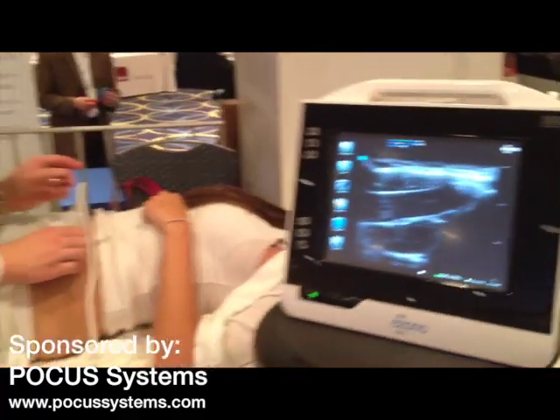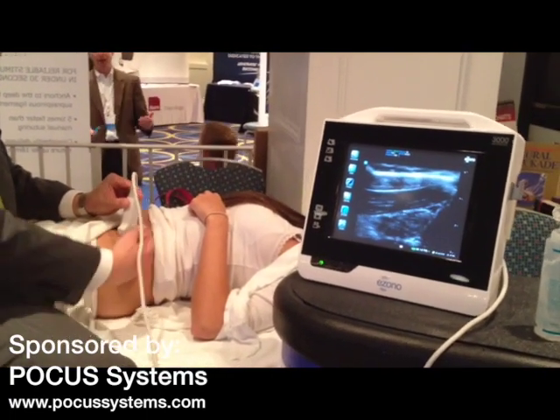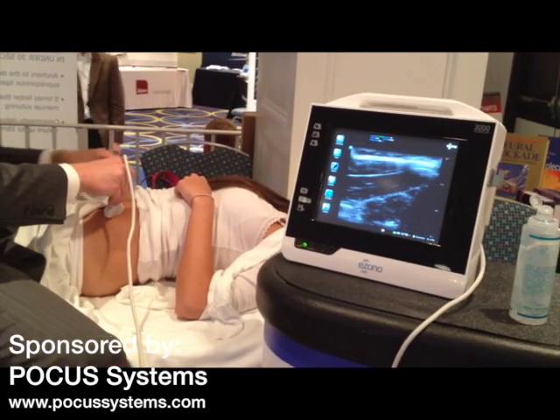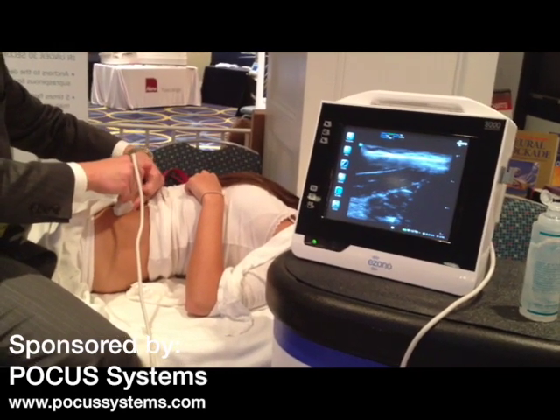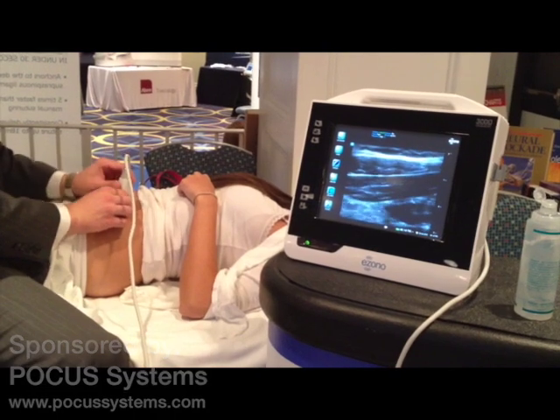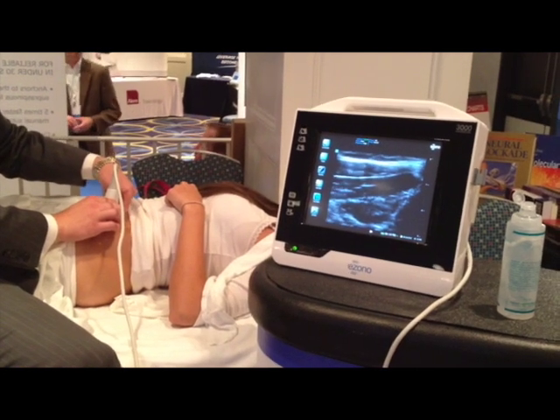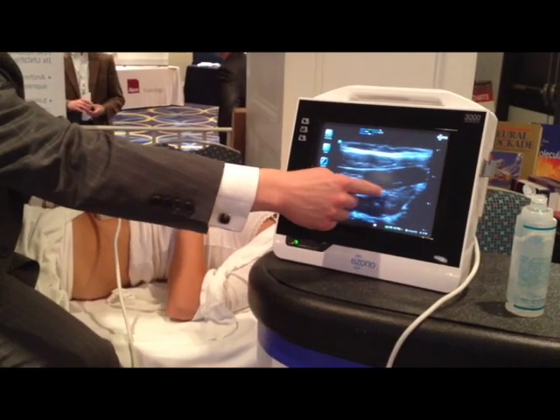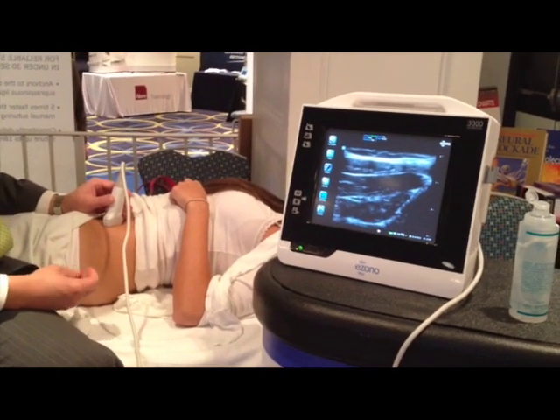Here's our target on the ultrasound screen, and you can note the angle of the transducer — it's coming off of the bone and angled towards the belly button. The needle will then be inserted in long axis view right here. You can see on the ultrasound screen, if I push where the needle would insert, you'll see the upper left-hand corner of the screen where it would come in. You place the needle tip right in this area and go ahead and complete the injection. This is the ilioinguinal ultrasound-guided nerve block.